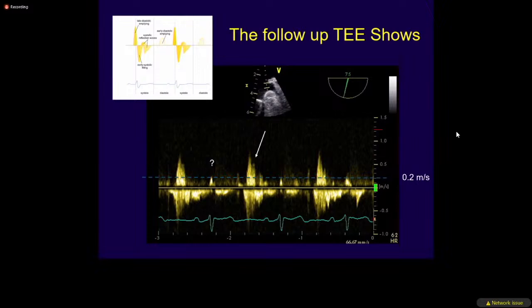You see that the waveform is actually normal by velocity, it is above 50, but it is diastolic, that's passive. The atrial contraction, which is the appendage, has to be after the P wave, not in the middle of the diastole. That's a passive mechanical. So this guy, actually, the question mark there is the appendage velocity, which is very low, below 20.